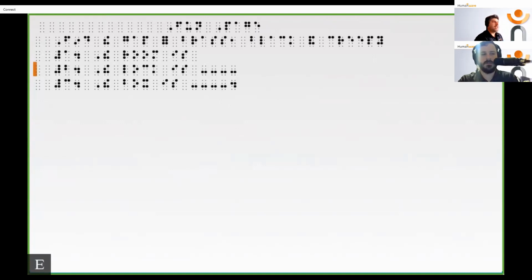in that gap. Now, when you open up a document using Keyboard F, the default view is read only. So if I start to type anything at this point, so if I just take myself back to the position where I want to type something.